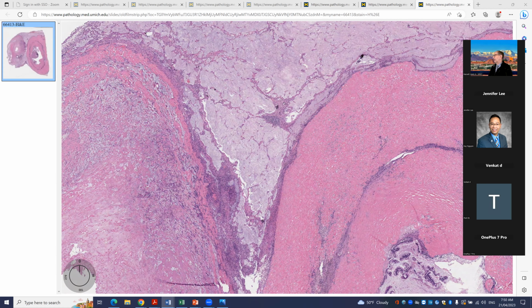Oops, let's see, looks like we didn't pick up the slide link. We'll pick it up here now.